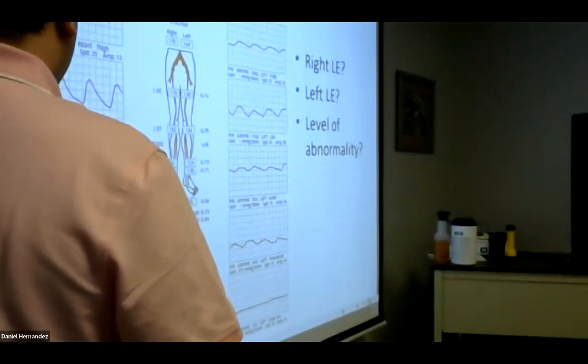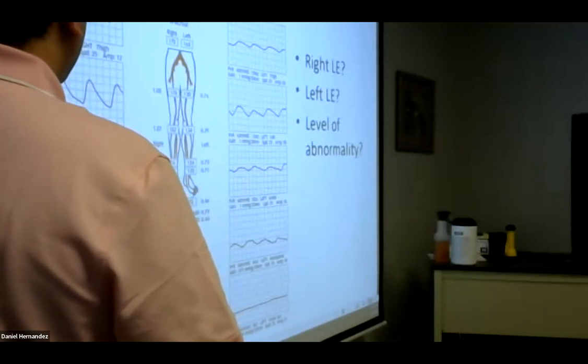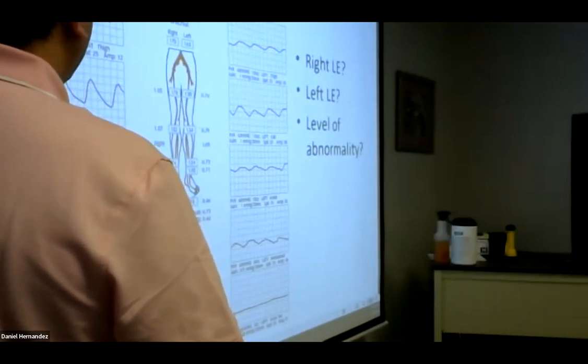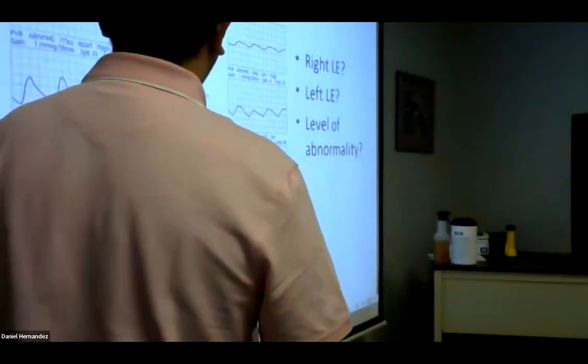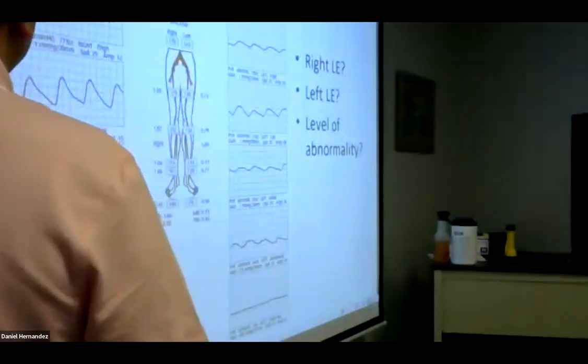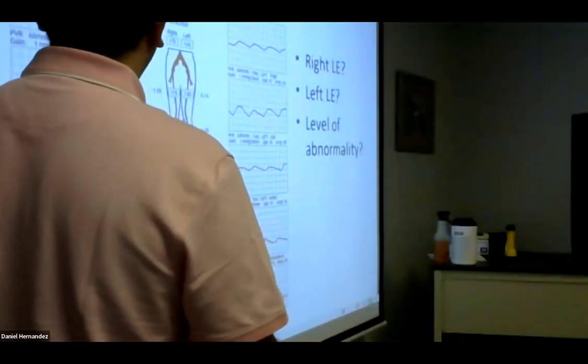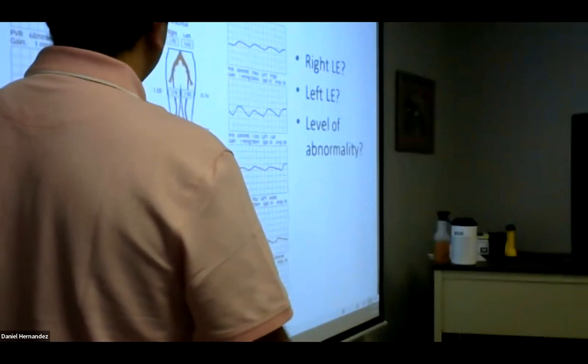It's probably like that because of the left iliac. I don't know, I'm just thinking, if it's occluded, it's gonna be affecting the right leg a little bit. That makes sense. If it's slightly stenotic, it's still gonna have to handle the blood, so it can increase the pressure.